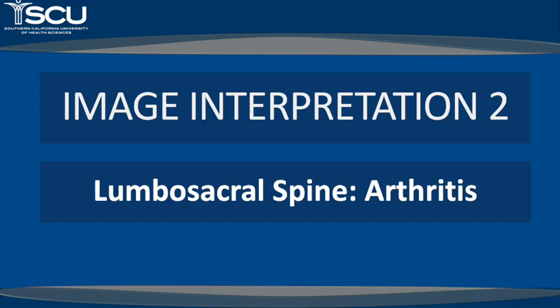That concludes our exploration of arthritis in the lumbosacral spine. I hope this presentation has provided you with a comprehensive understanding of the radiographic features, diagnostic considerations, and clinical implications of various arthritic conditions affecting this region. Remember, a thorough knowledge of these entities is crucial for accurate diagnosis and optimal patient management.